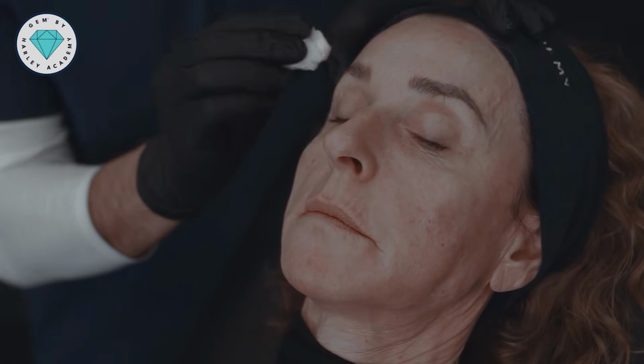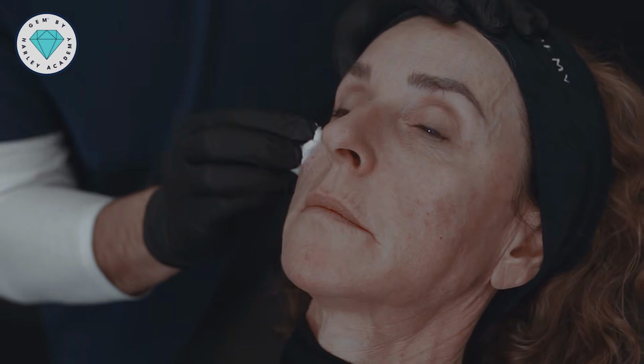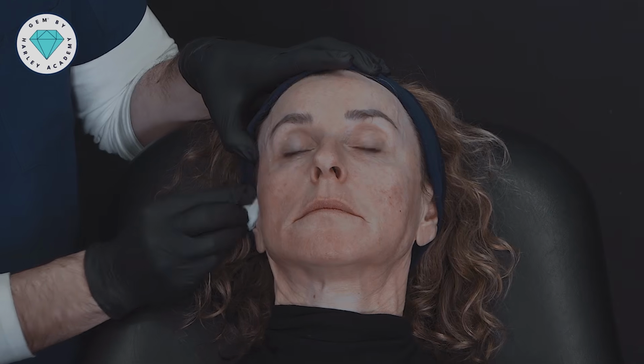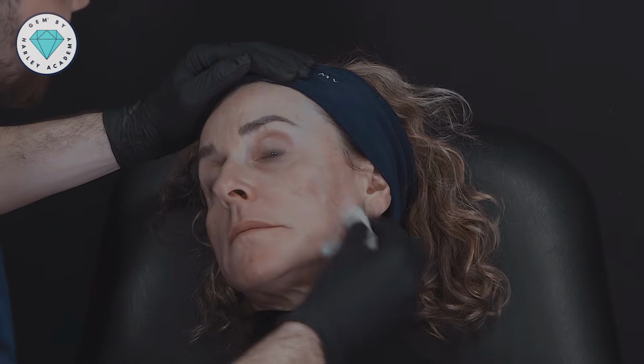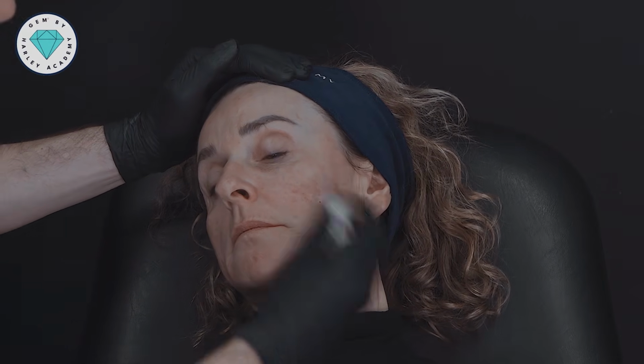Okay, now I'm going to take off some of the markings on this side, and it would be great to compare one side to the other. So we haven't treated the medial midface yet, we've just treated the lateral midface, creating some definition at the apex and also the preauricular. So let's take a look, sit forwards. Great.